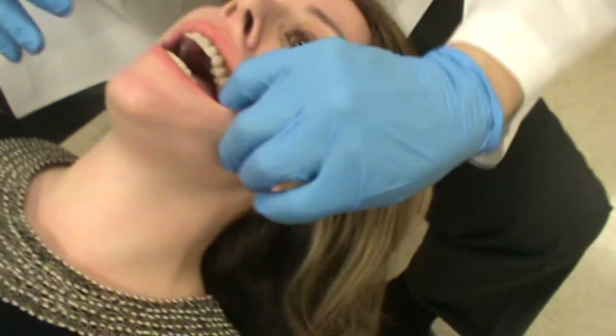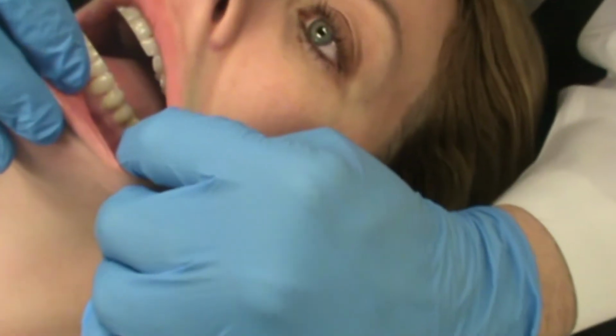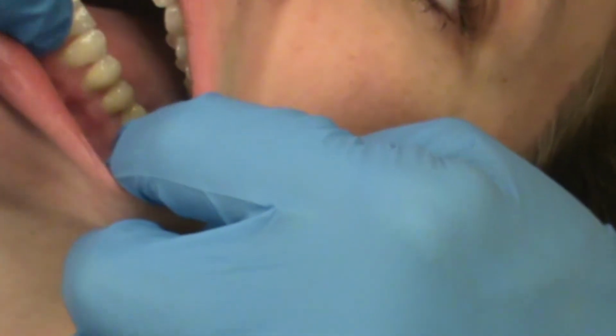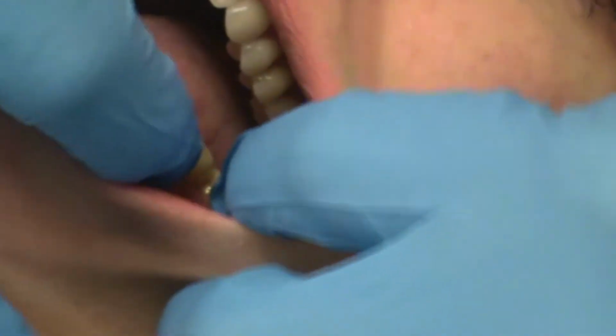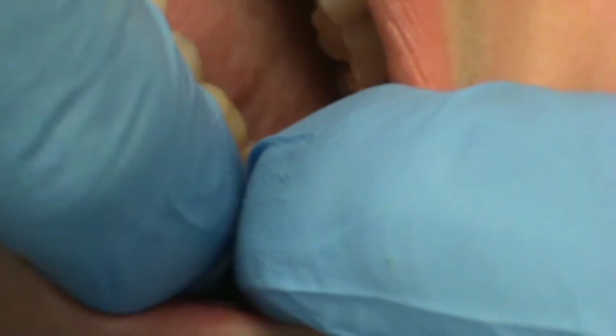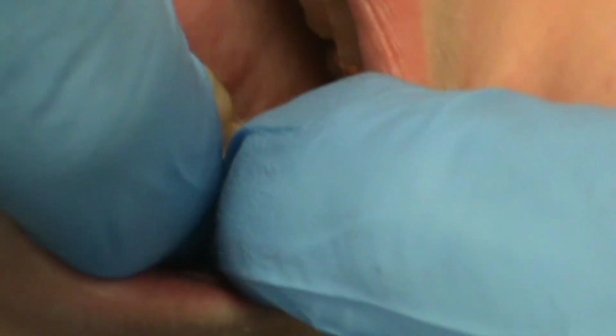Okay. So another injection we can give is the mental. The mental numbs up the tissue to the midline from about three-quarters of the way back on the second premolar. The way to find the mental, it's kind of low. You start with your finger above the first molar, slide forward, and you'll feel a depression.